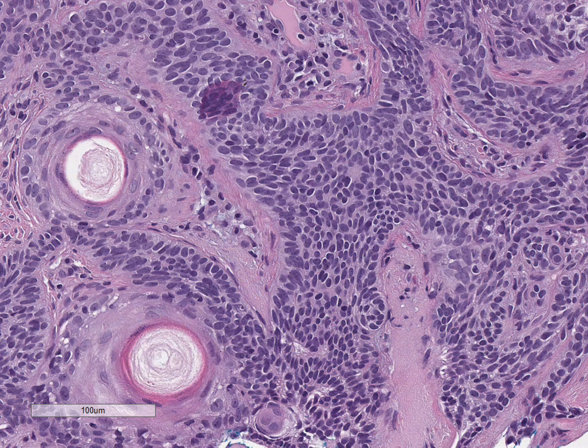Coming up next is a BCC variant with adnexal differentiation, and as you can see here, this is showing some infundibular or follicular change. So this is BCC, infundibulocystic type.